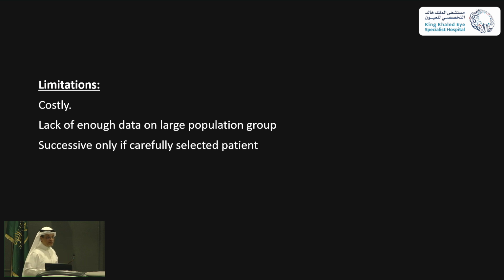Any procedure has a limitation. The limitation here is that it is costly because you open a vitrectomy cassette, and the data is not enough because the sample was small and there was no control group. And in this case, success is similar to pneumatic; if we select the cases well, you may have good results.